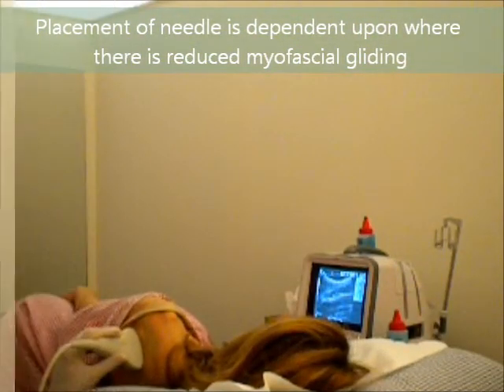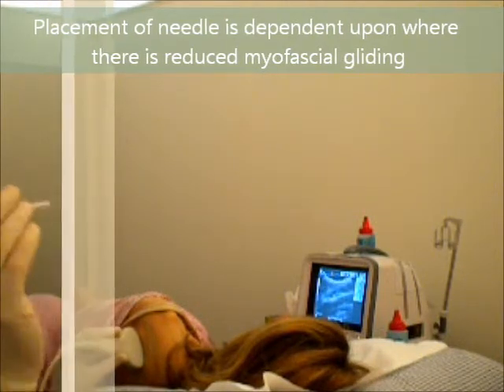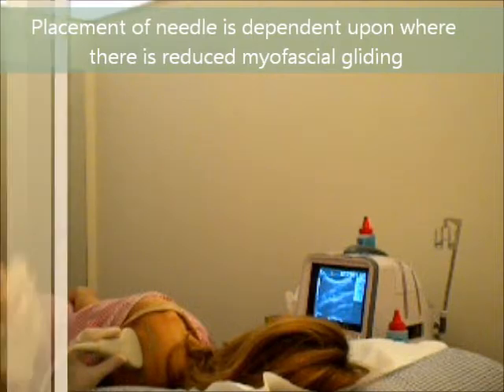Now here we're going to use the real-time ultrasound and an acupuncture dry needle, and we're going to guide the needle using the ultrasound into the trigger point.